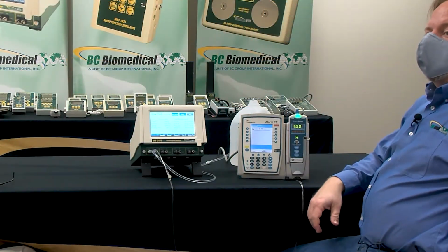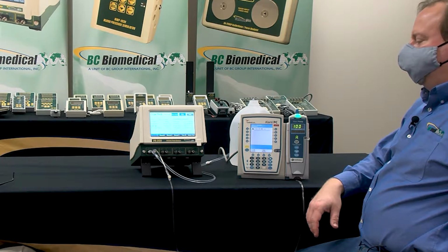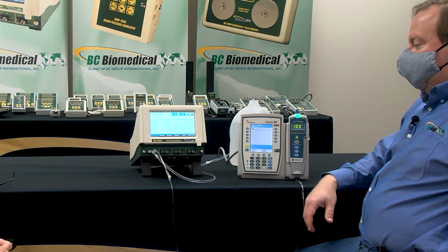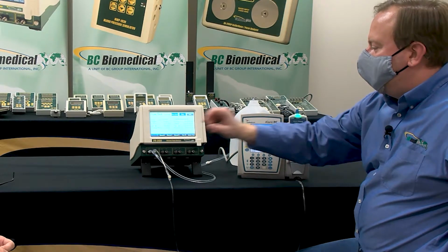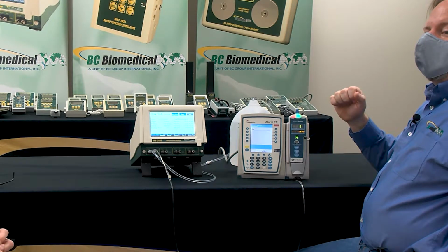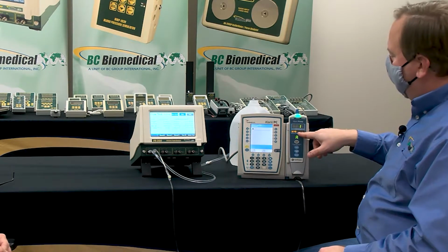You set the expected flow rate on the 3400. Then you set the same flow rate over on the Alaris. And when you talk about the pressure, we get to a certain pressure before it starts. So this here is the current pressure. We set it to 0.2, and so it's trying to maintain 0.2. Do you set anything over there? It's just measuring flow rate. So it's just taking the flow rate from there.